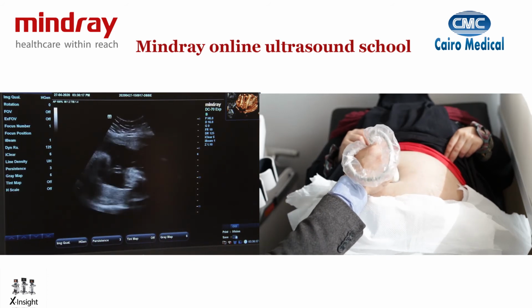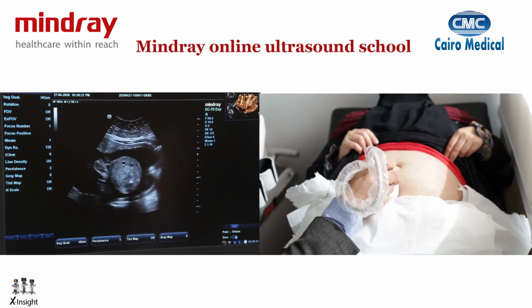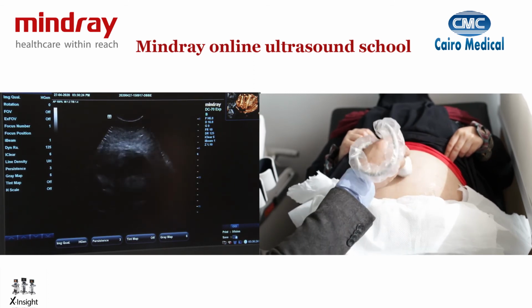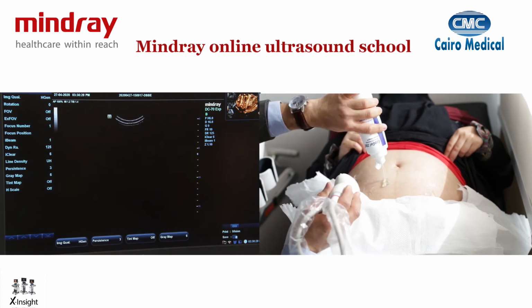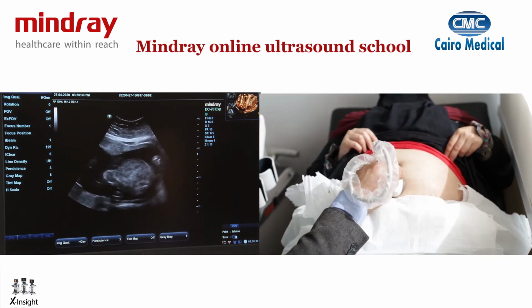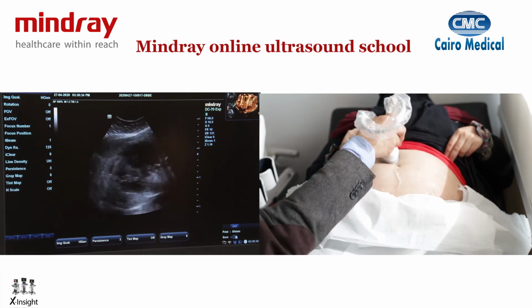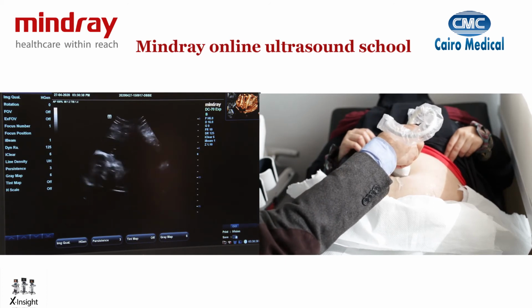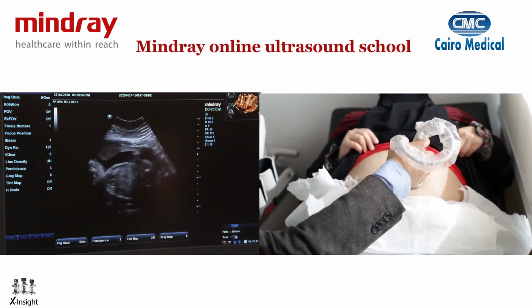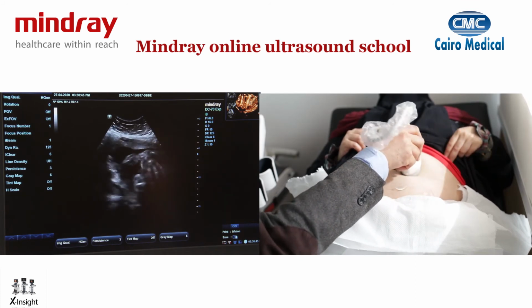So let's do a little bit more surface rendering before we go through multiplanar imaging, as I explained in my lecture. If we're doing more surface rendering, let's have a look, for instance, at the fetal abdomen or the fetal spine. Over here you can see, if I put the probe longitudinal and I keep it longitudinal, then I could see the face. If I keep going down, then I could see the fetal limbs, as you can see them here.